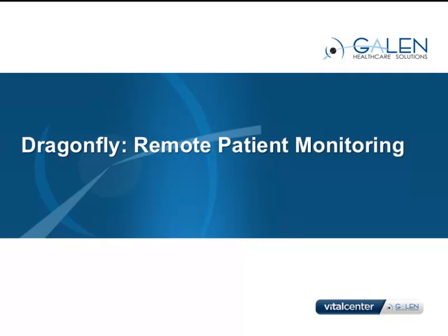Dragonfly, Remote Patient Monitoring, enabling providers to keep track of patient needs at a faster rate and ultimately improving the quality of patient care.